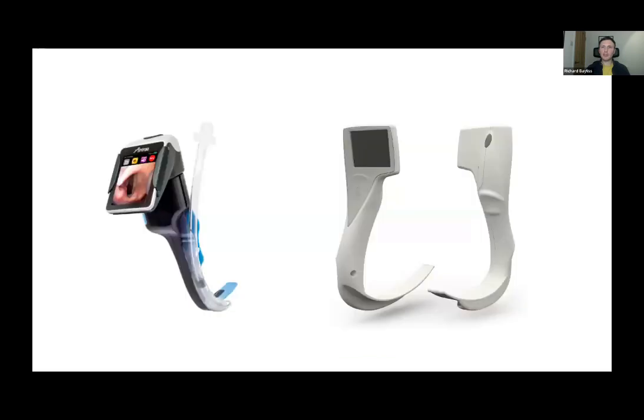So what devices are out there at the moment? On the left is the first video laryngoscope that I've ever used, so that's an AirTrack. It's a single-use device, although they have now made a reusable version as well. It uses a series of prisms to convey an image from the tip of the device to the operator. Either you can look directly down the device, or as here, there's a camera attachment that fits on the top of the device.